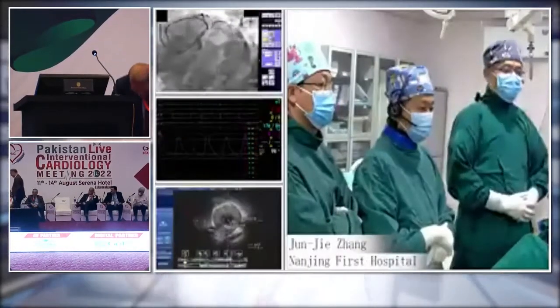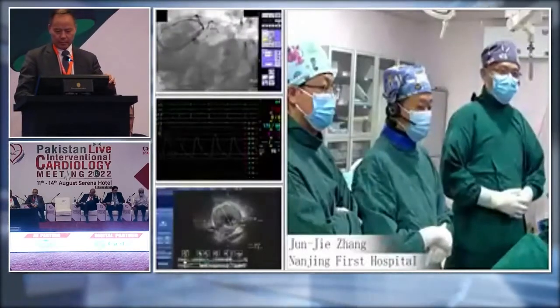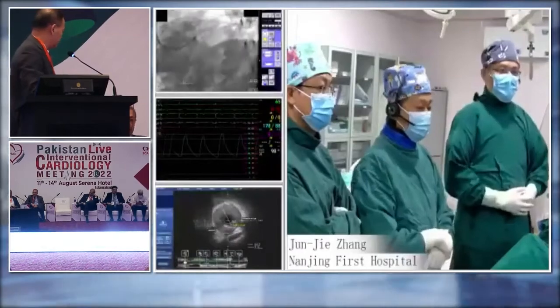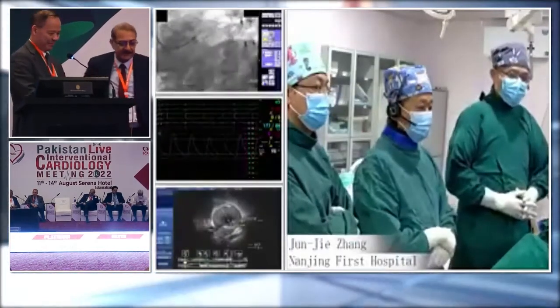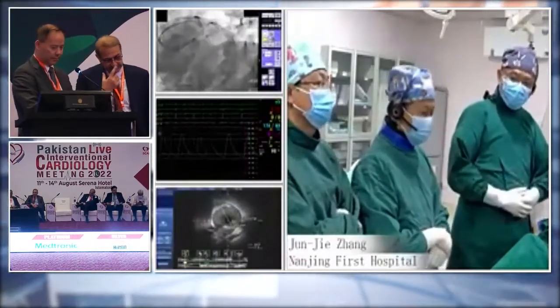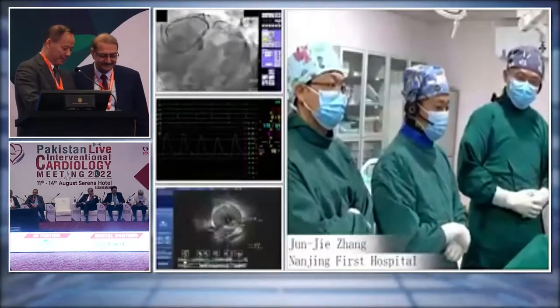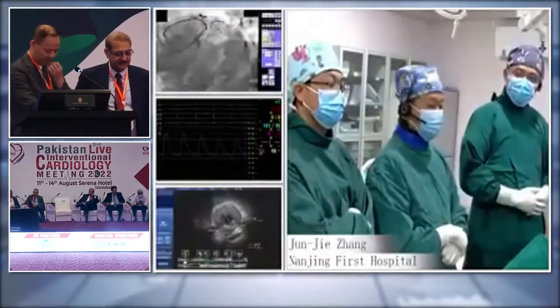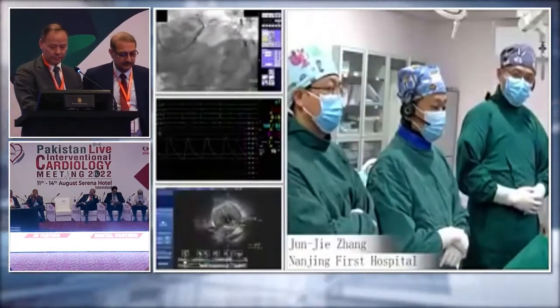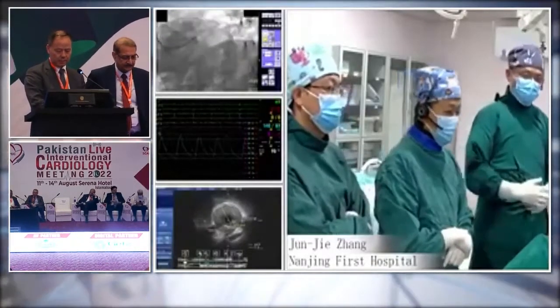Sure. I'm Dr. Jun-Jie Zhang from Nanjing First Hospital. On behalf of Professor Shaoliang Chen, I really appreciate your kind invitation to participate in Pakistan Live 2022. So Dr. Raza, first, let me introduce my team. On my right hand, Dr. Ge Zhen and Dr. Li Xiaobo will assist me to perform the case. And also our technician in chief, Mr. Pan Tao, will interpret the IVUS. So first, let Dr. Ge Zhen introduce the case information. Please, Dr. Ge Zhen.